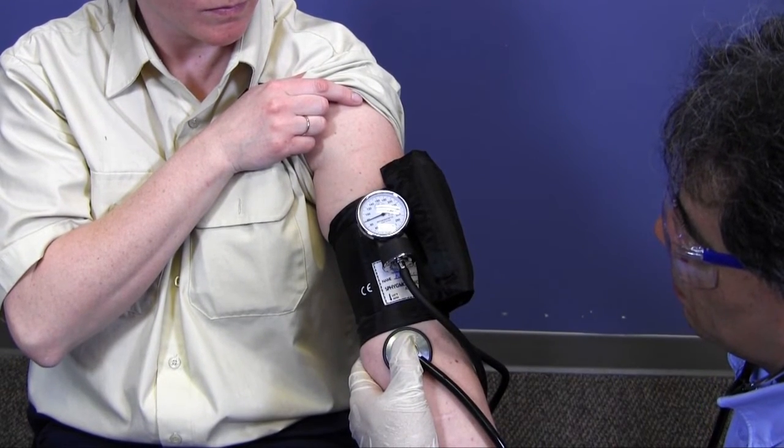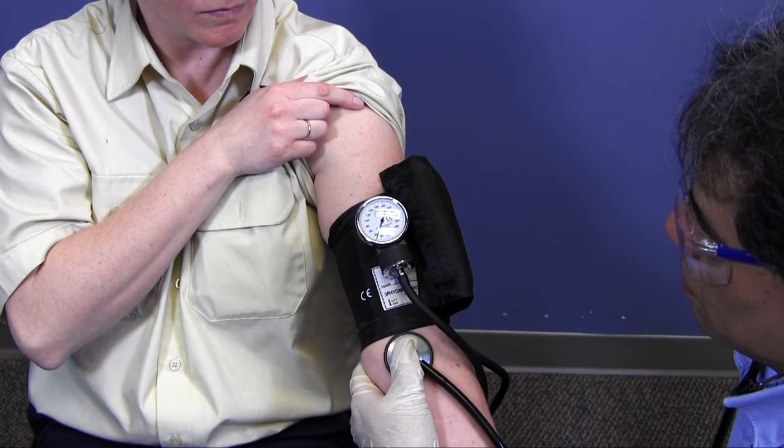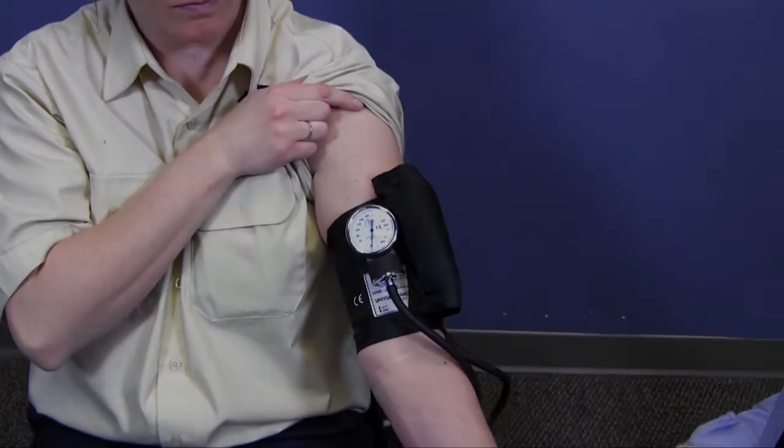I slowly release the cuff pressure. I identify the systolic and diastolic pressures, verbalize, and document the results.